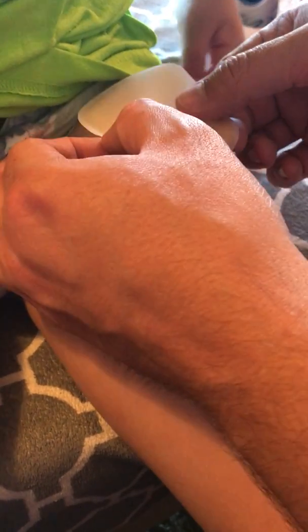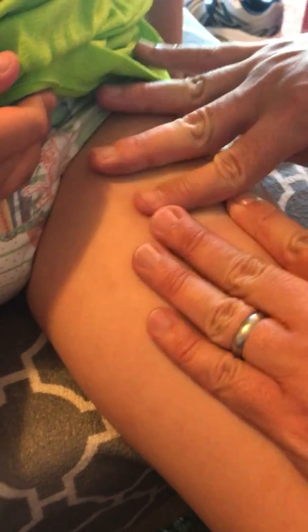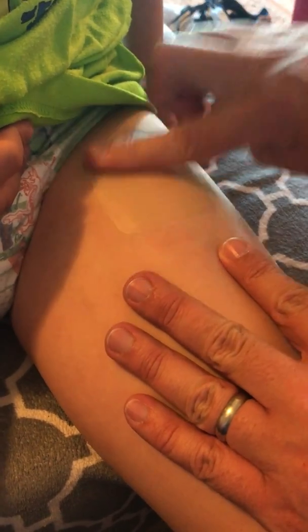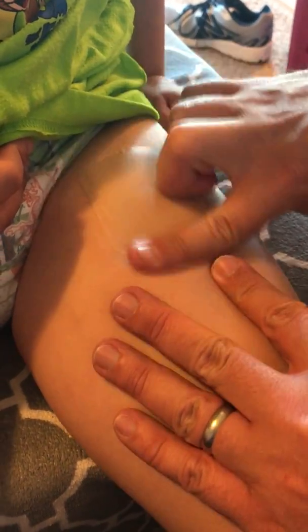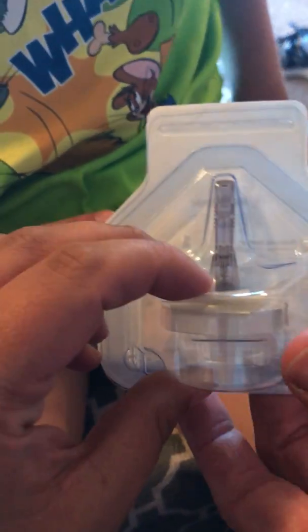That's good. You just kind of put that down. He gets really bad rashes, so this kind of helps with the rash itself. It's like a second skin.